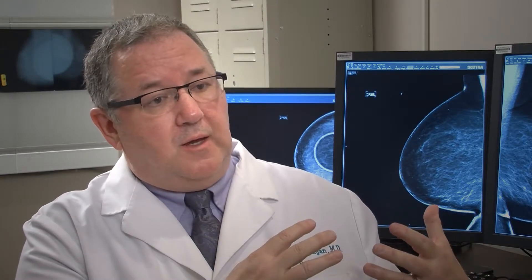However, if you have some symptoms related to one breast — let's say you felt a lump, you have some pain in a breast, or a discharge — then we do a diagnostic mammogram. That starts with the four screening views, and then we take additional views of the symptomatic breast. These may be special angled views, further compression, or we may use a small paddle device that acts like a cone to give us a magnified view. You end up with about 8 to 12 images of that breast, as opposed to the four images from a screening mammogram.